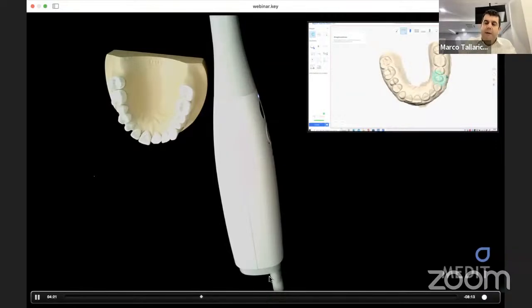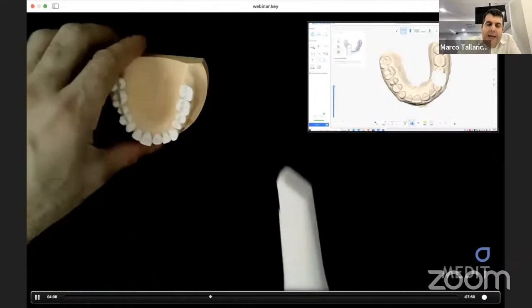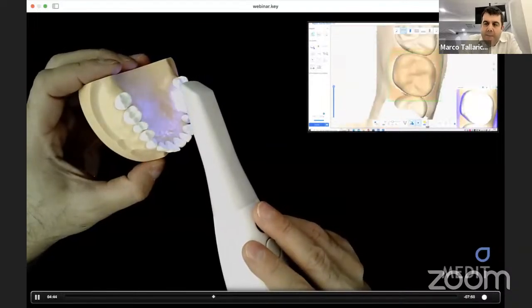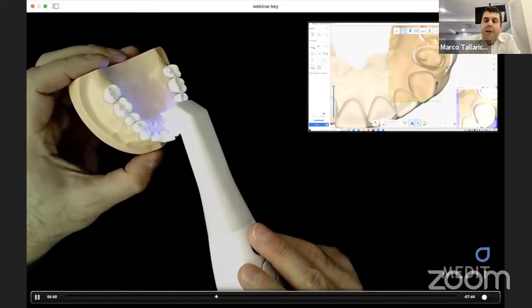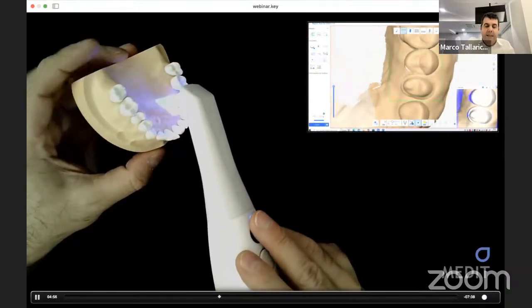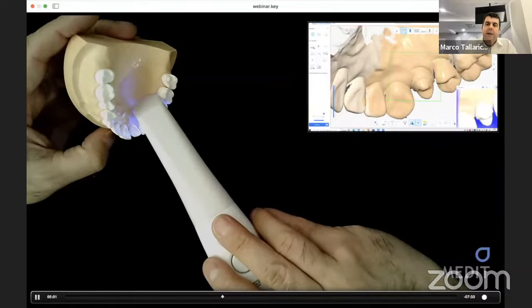Now I'm cutting the abutment because I want to take it with high resolution. For example, I use the double cut technique. In case of natural teeth, I remove the cords, put the scanner in high resolution, and take just the cut area. So I start from the surface of the molar because it was already acquired. You can see the color is different because the scanner is in high resolution. This means that we have a more defined mesh with more points in my mesh.